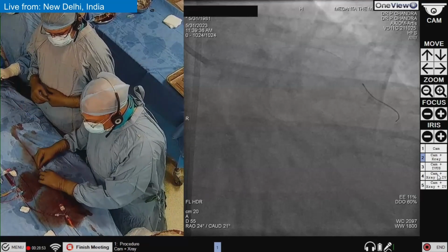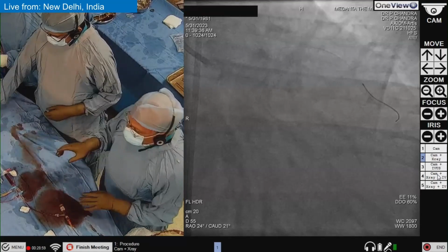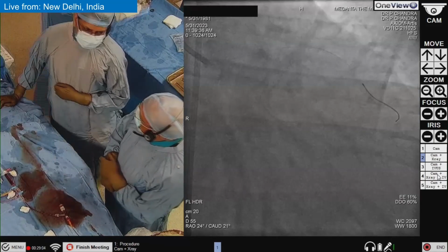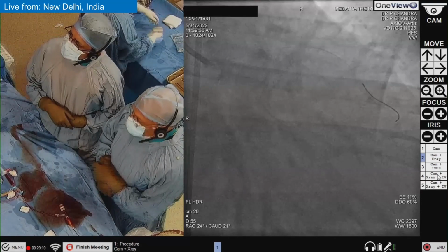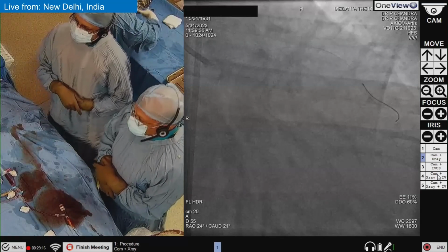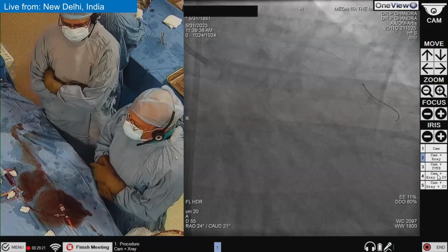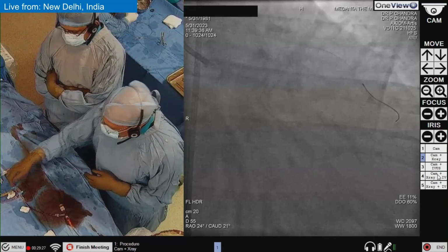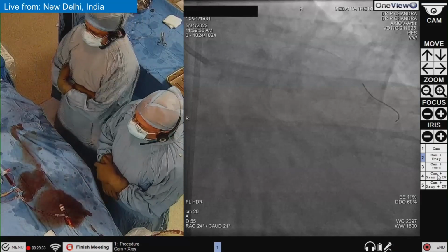Now we have to take the stent. So we have to take a long stent, and so we have the choices. The choices are, we can take a 48 or take a 60. 48 may be sufficient because this is 32 by marker, and then 32 plus maybe 20 more. So 50 is minimum. I think 48 or 50 maybe, or 60 will have more margin. Otherwise there will be a chance that we have to do a second stent.